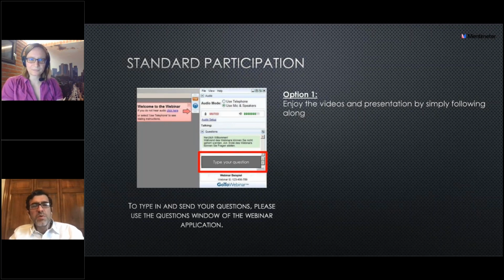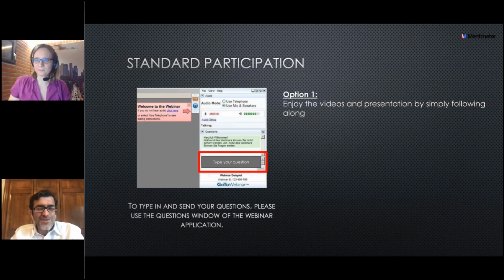That's again a very good indication. I always keep this subthreshold laser as an option for any of the papillomacular bundle leaks. I think the extra precaution is that you keep asking yourself, are you doing microsecond laser? Are you at the correct settings? Because we have had episodes where we missed that we were not on the microsecond laser mode, we were on the continuous wave laser mode, and that can be really disastrous.